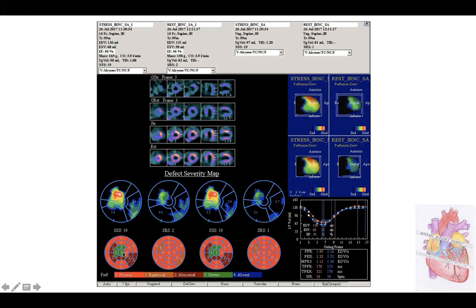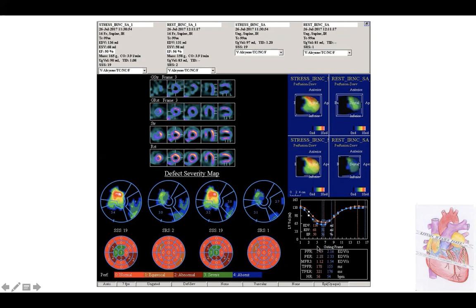The summed scores give information about the extension and severity of ischemia at stress and at rest. It is very simple to read — we sum the points in the different segments, like in echocardiography or CMR. Zero is normal, four is absence of tracer uptake. The area of perfusion abnormalities after stress is very high because the area of ischemia is very large. The number at rest is very low because we have only a small area of reduced perfusion. We also have information about diastolic function, which is reduced during stress — 1.89 at stress versus 2.16 at rest — so there is a reduction of both systolic and diastolic function.